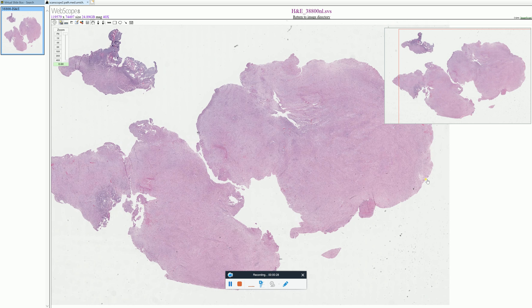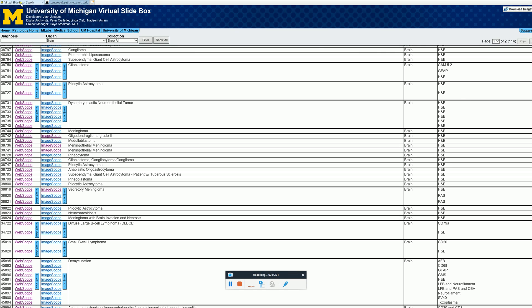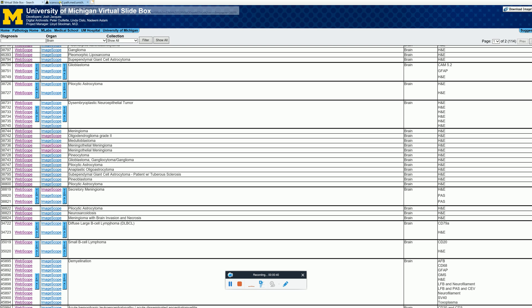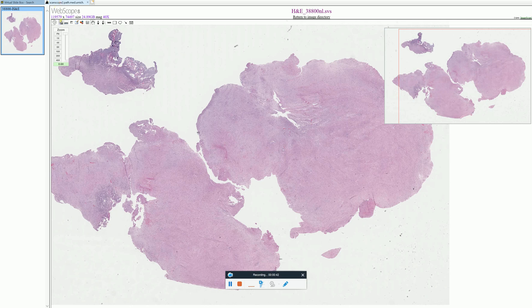Today we're going to be looking at this brain tumor. I wanted to give a shout out to the University of Michigan — they have a virtual slide box that's great, and that's what I'm going to be talking about today: one of their slides. So check them out if you get a chance. This patient had a tumor in the brain or spinal cord. A neurosurgeon went in, took it out, and gave it to me, the pathologist, to make a diagnosis.